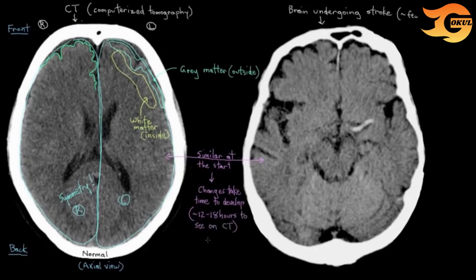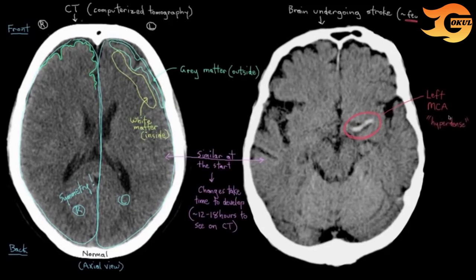Even though you might not be able to see brain tissue changes right after a stroke on a CT scan, you might be able to see a clot that caused it. Here's a CT scan taken pretty quickly after a stroke — within a few hours — and what you might notice is this thing here, which is actually the left middle cerebral artery. It certainly stands out; one might even say it looks hyperdense. This is called the MCA hyperdense sign, and it signifies that there's possibly a clot there.